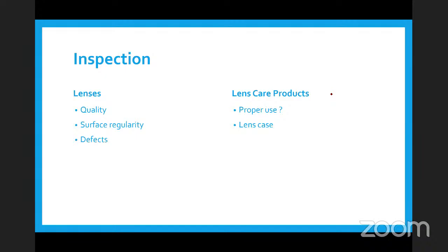One key point to note here is, inform the patient what you are doing, because it's the patient's property. The patient has bought the lens. What happens if, while doing the inspection, by mistake, or if there was a small crack, it cracks more? So tell the patient that now this is the time I'm going to inspect the lens. The patient is sitting in your room anyway.